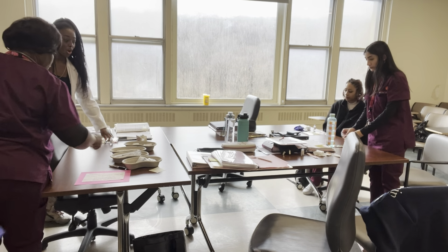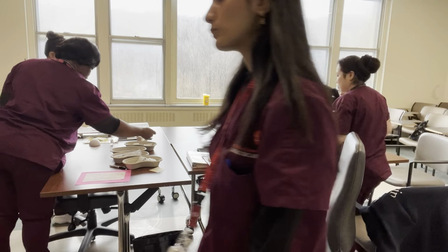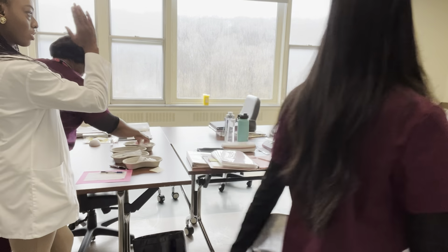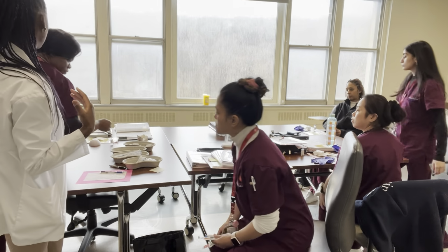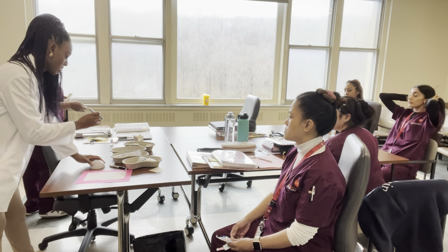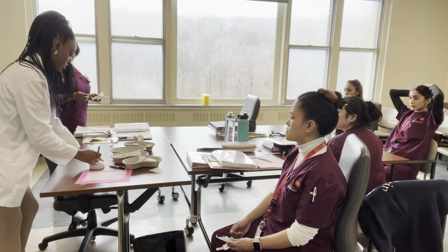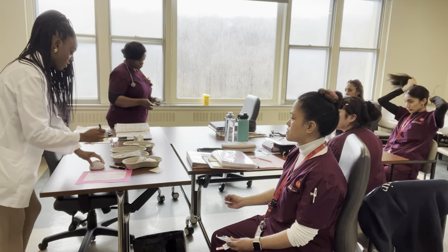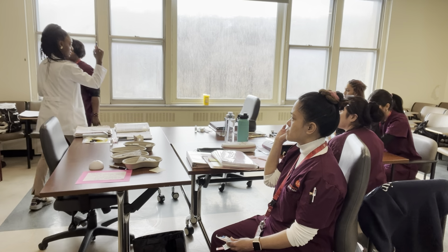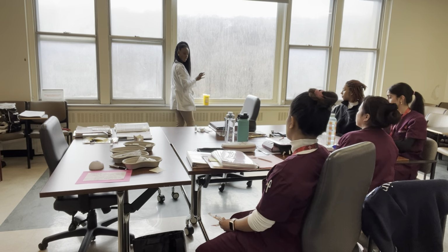That's fine. Oh, and I forgot to mention, because I was so close to the actual place to inject, I didn't do one thing, and I'll show you what to do. When you are dealing with a needle and you have to walk across the room, or walk a distance away, the most important part is, I'll pretend like this is the syringe. When you come out of the person's skin, put your hand up in the air, don't manipulate in any way, just take it straight out of the patient's skin, put your wrist up, and then you drop it into the sharps container. Does that make sense? Is it clear?